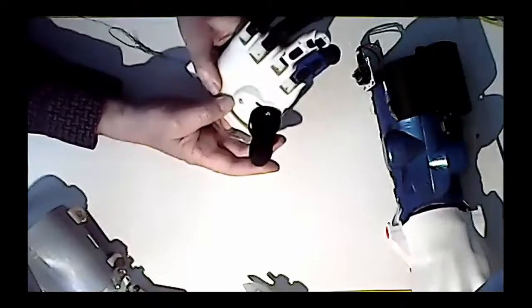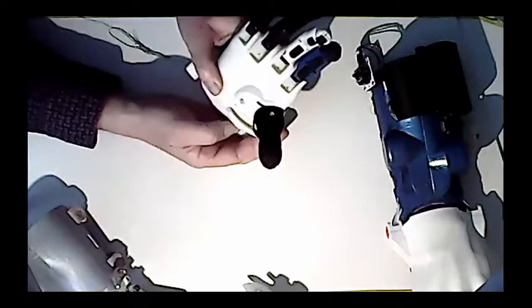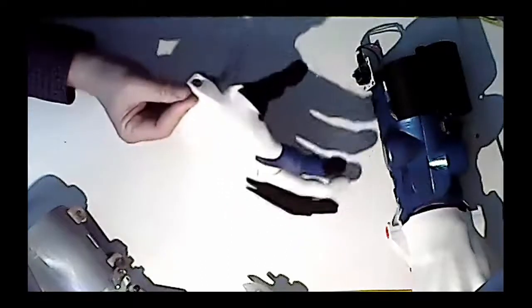So this is the first try. We are trying to find a way to move the thumb in two positions. This is the rest position. And here would be the picking position. So that time, the thumb and the forefinger close together correctly to pick something. So this is quite complicated. Here it works because we are moving the finger by hand. The goal will be to automate this by a solenoid or something else to move the finger in or out.